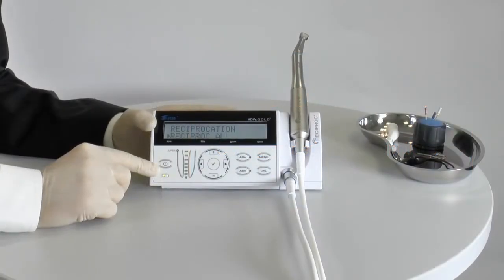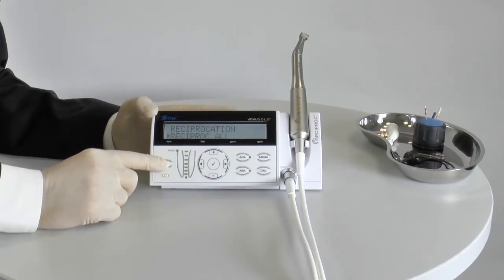To start your VDW Gold Reciproc press the power key. You can find this key above the battery icon. When the battery symbol lights green, the motor is ready for use.